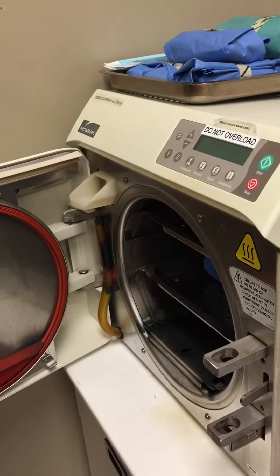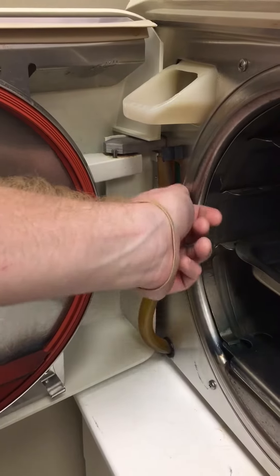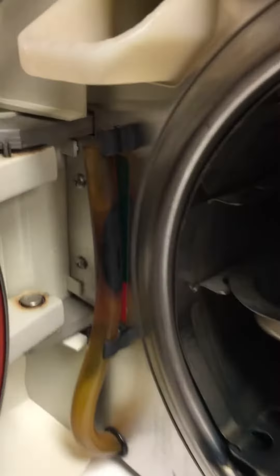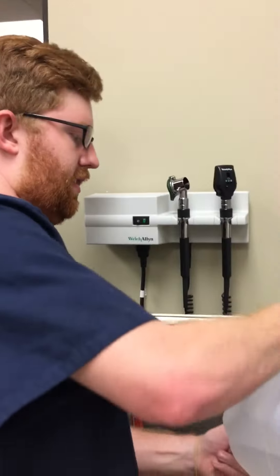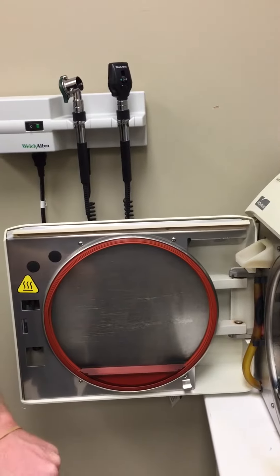On this machine, to refill the water if needed — right now it's currently at the necessary level. You look right here, and if it's at the green, it's good to go. Just to demonstrate, because sometimes it does need refilling: ours has this little area right here where you put the distilled water, and you always want to make sure that it's at a proper level.